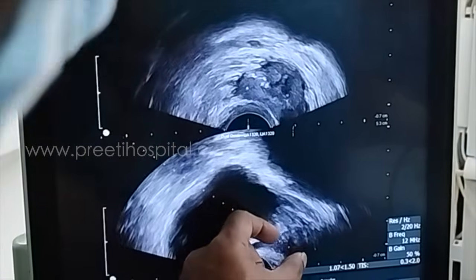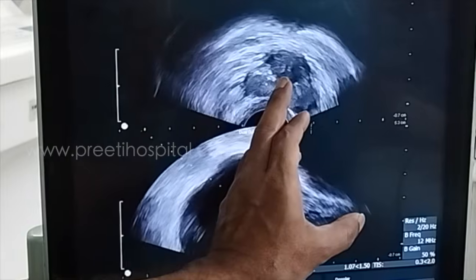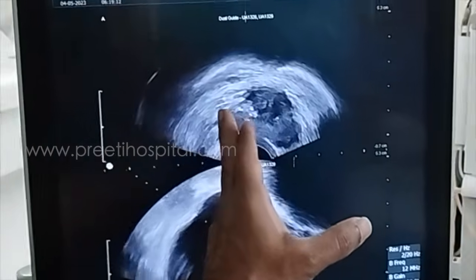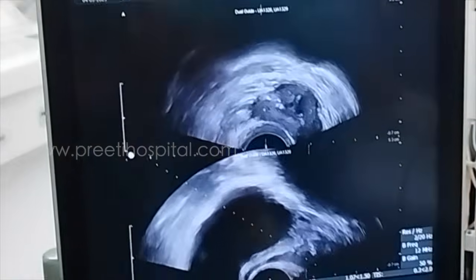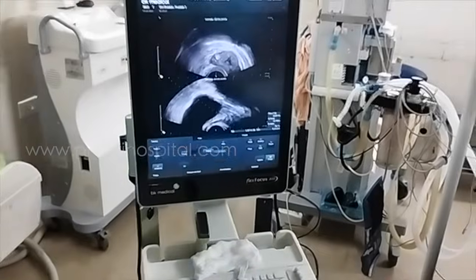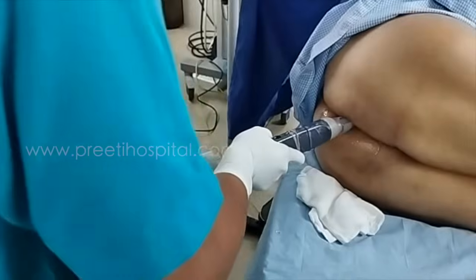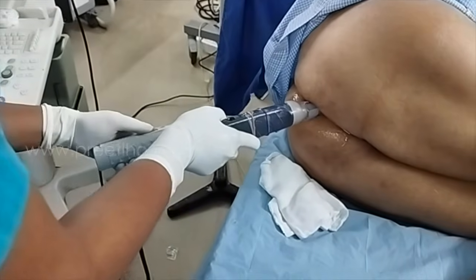This is only the small base periphery. After that, you will come to the center, like this. First you go to the base, to the medial right. First you go right side, extreme lateral here. I will help with the gloves, and I will insert the needle. Do you think the insertion should be done by another person? Yes, for stableness, to keep it stable.